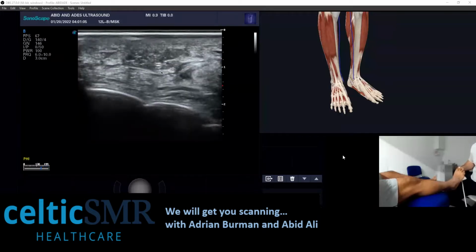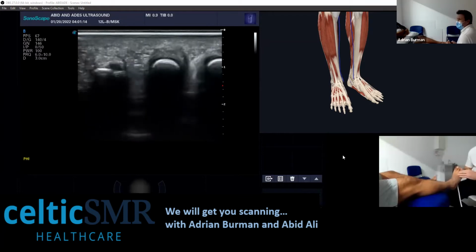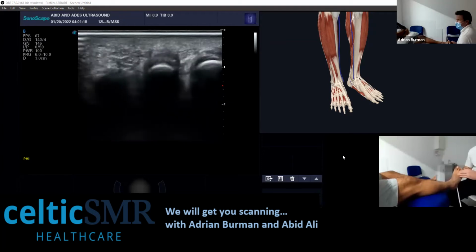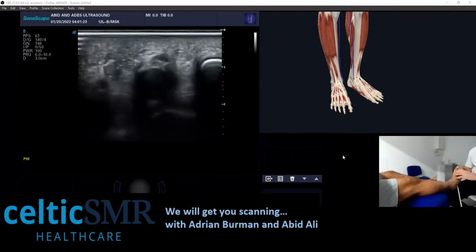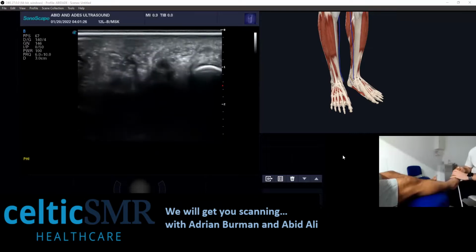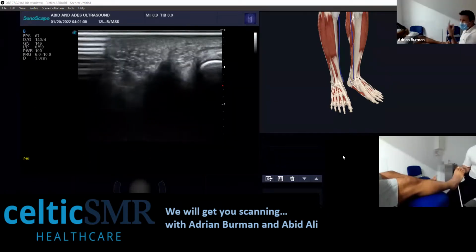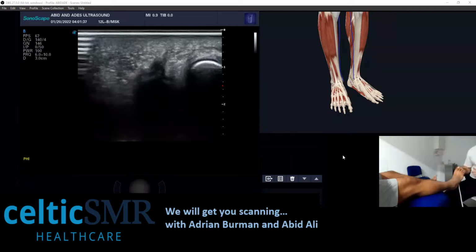So you're sort of looking for an effusion to come through between the mets type of thing? No, I'm looking for the jump in the neuroma. They tend to be a complex, a bursal neuroma complex, so you may get a little bit of fluid as well. When you squeeze, you'll see a dark blob, and it will pop. I mean, it's up on the screen, but it's actually down on the foot. Yeah, I understand. Okay.